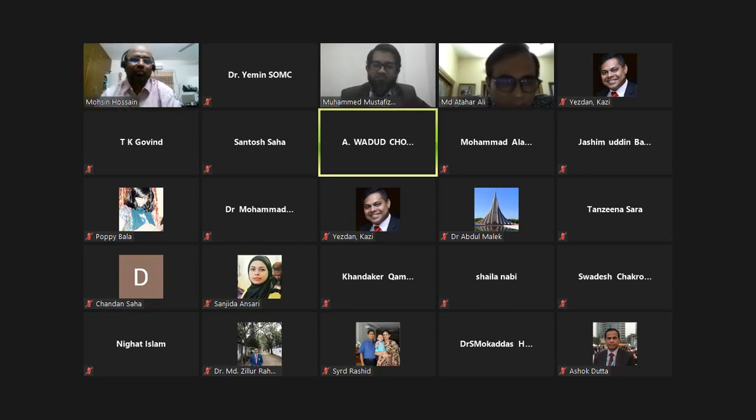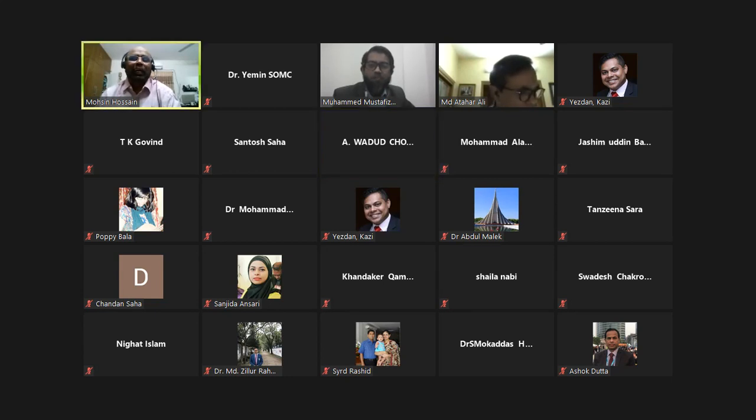Mohsin, I wonder, what is the pathway of this retrograde conduction? Does it involve the junctional tissue? Mainly there are two mechanisms. PVC is the main one. And if there is loss of atrial capture in a dual-chamber pacemaker, these are the two mechanisms by which the PMT can initiate. So the PVC can go through, sir, and a retrograde conduction must be present. So it goes to the native complex, and the atrial lead can sense it.